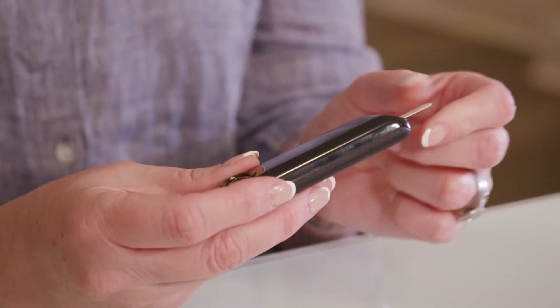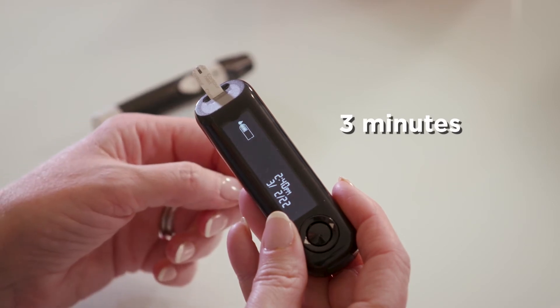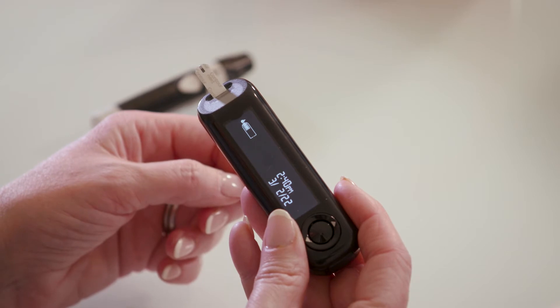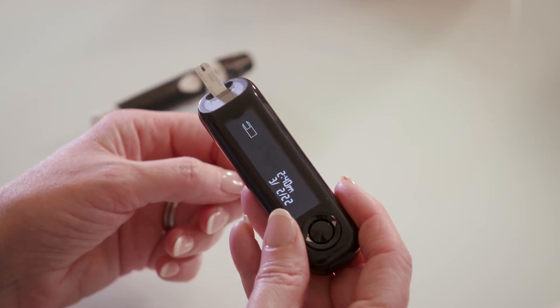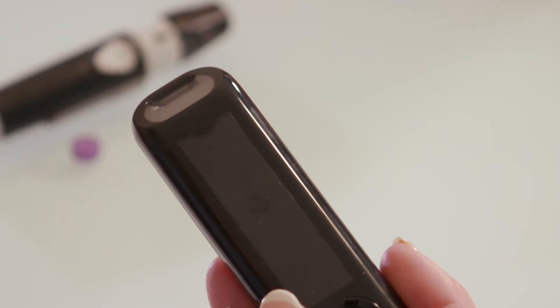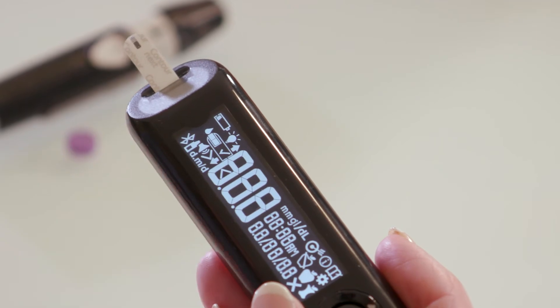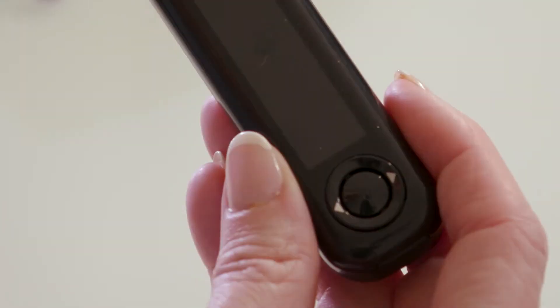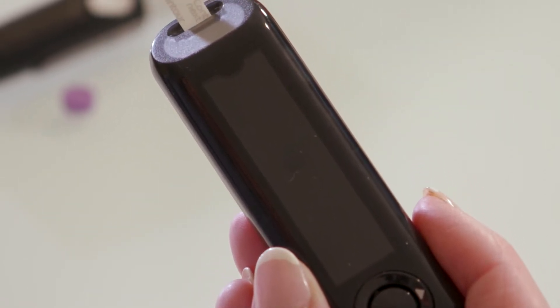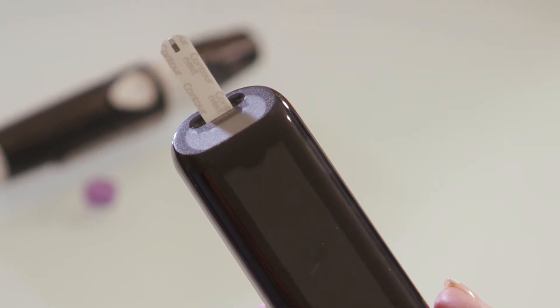Once the meter turns on, you have three minutes to apply a drop of blood to the test strip. If you don't apply a drop in time, the meter will beep and turn off. If this happens, just pull the test strip out and put it back in. Never apply blood to the strip when the meter is off or before you put it into the meter. This will ruin the test strip and you'll have to use a new one.